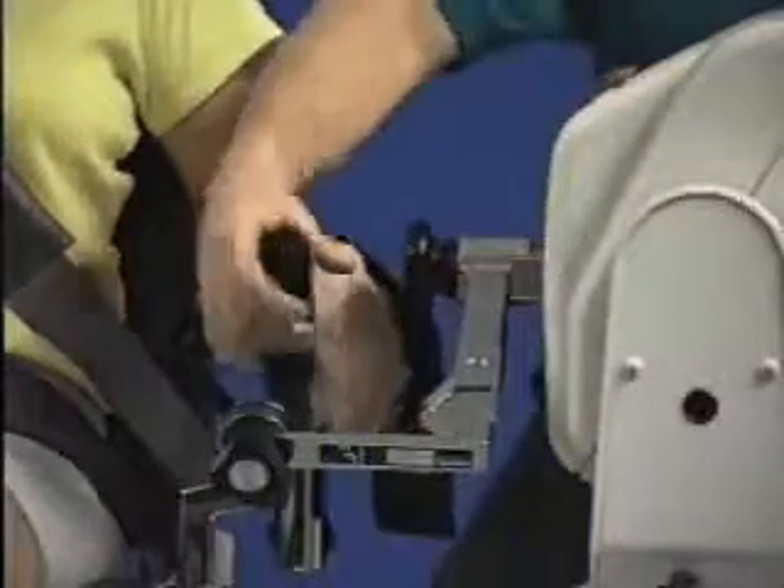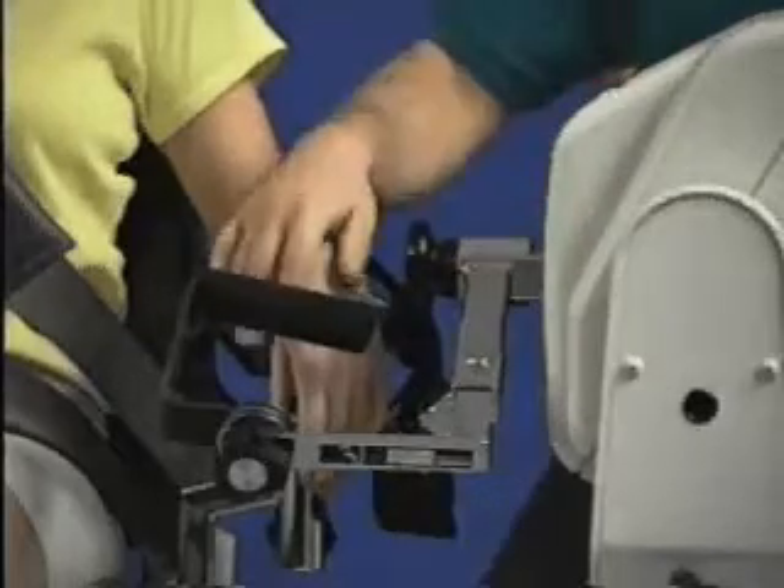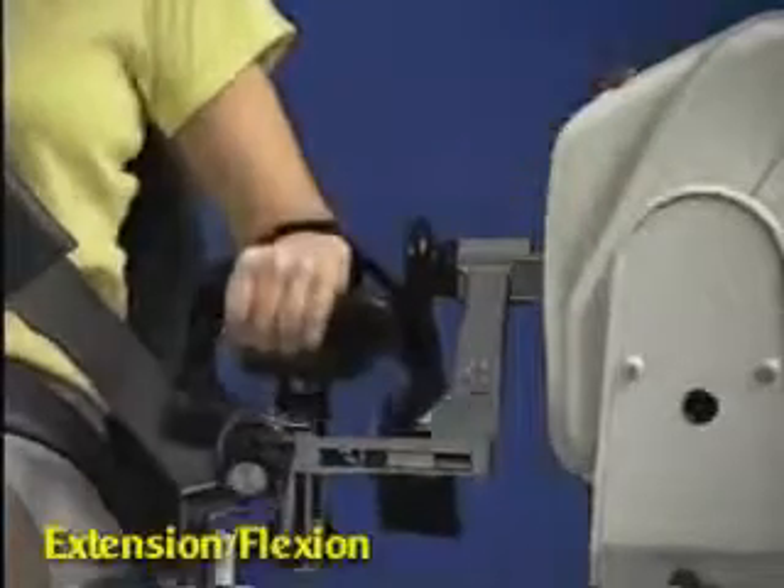To switch to extension/flexion, simply rotate hand grip angled in and reset range of motion stops.